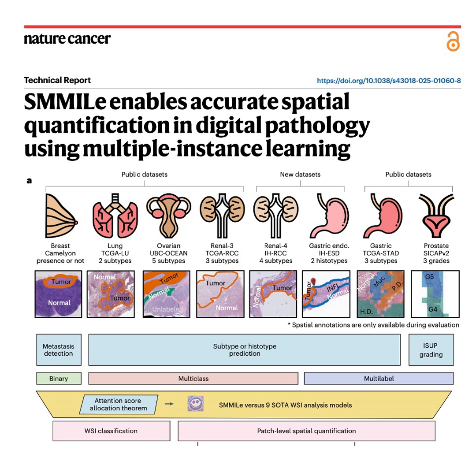For memory, I like to visualize a literal smile slowly spreading across a massive slide, making sure it touches every corner. I like that. So step 1 makes sense. Slide preprocessing. The gigapixel image is simply too big. Right. So first, SMMILe uses neural image compression, NIC, leveraging a pre-trained encoder to extract features and compress the WSI. But it doesn't just overlay an arbitrary grid. It tessellates the image into what they call superpatches using an algorithm known as SLIC.